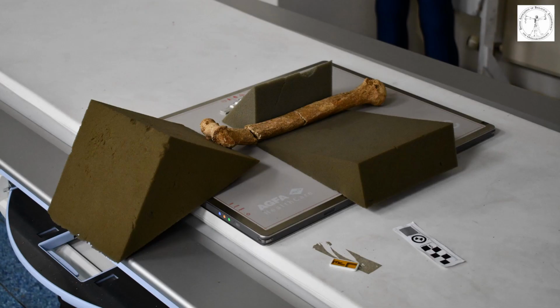Accurate radiographic imaging of any bone with more than one break, like this one that's got two breaks, it's in three pieces, was really down to patience and precision use of the sponges to achieve good imaging. And then you have to question yourself, what am I going to find? Is it going to be of any use to me? But it is possible to have good imaging, it just really takes a lot of effort.